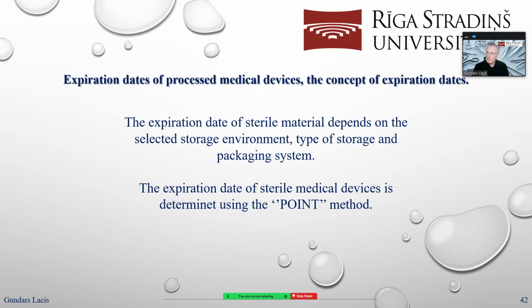The expiration date of sterile material depends on the selected storage environment, type of storage, and packaging system. Expiration date is not connected with the sterilization method. All sterilization methods must reach the same reduction level. Please never think that the sterilization method makes a storage date longer or shorter. Only the packaging system, where it is stored and how it is stored.